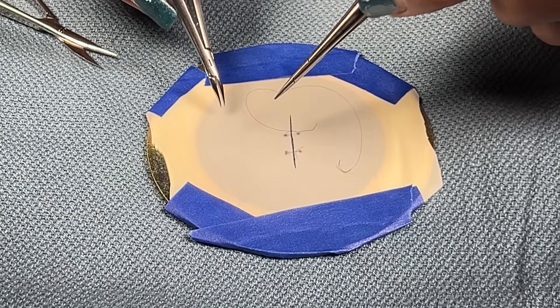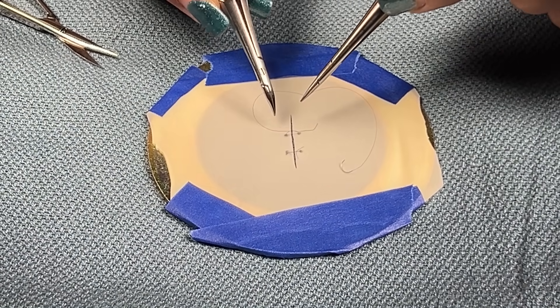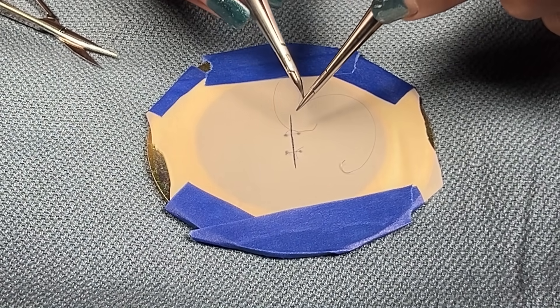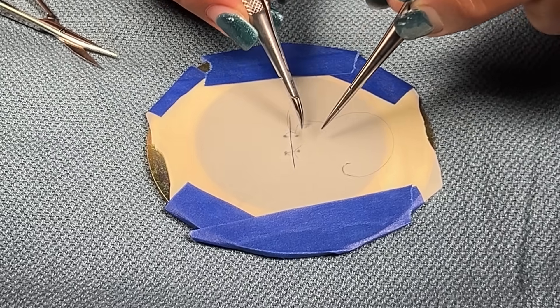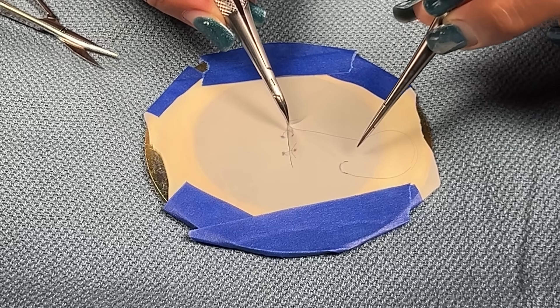You're going to bring the long end towards the tail end. Using your driver, go under over, grab the tail, and pull that through.